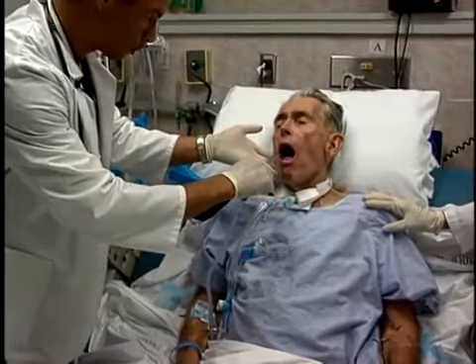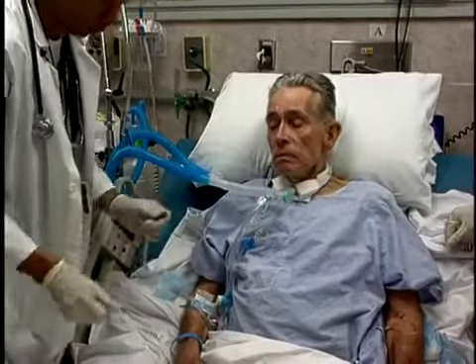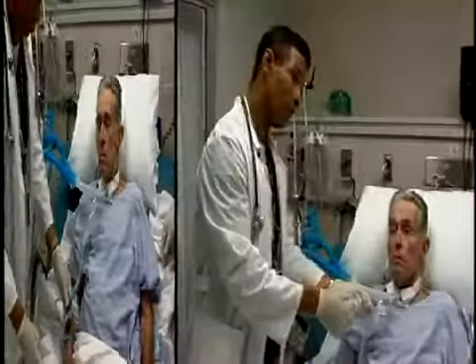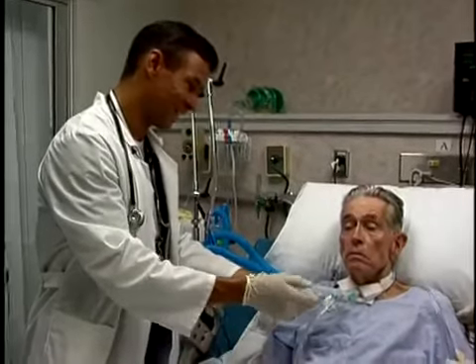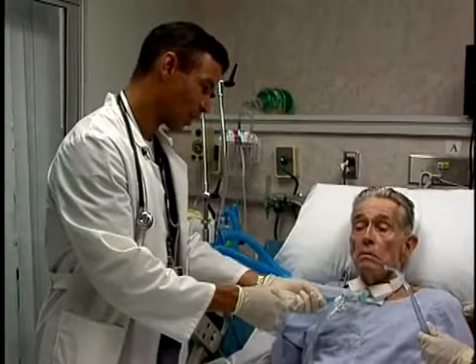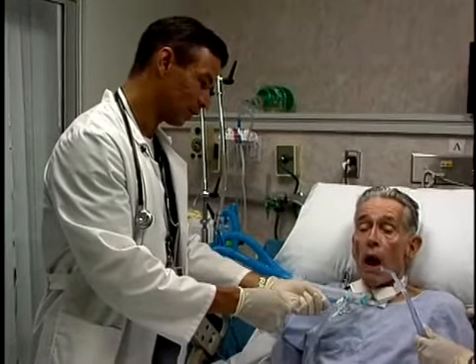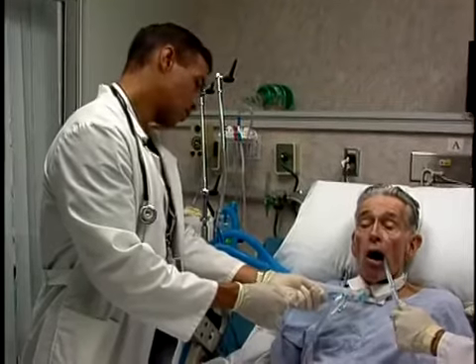Allow your patient time to recover from suctioning. Then slowly deflate the cuff, taking 1 to 2 minutes for complete deflation. This allows for gradual acclimation to airflow through the upper airway. This gradual flow stimulates the oropharyngeal muscles, facilitating improved function, which creates tone in the upper airway, and in turn creates resistance that will prevent large amounts of air from escaping through the mouth and nose during the inspiratory cycle.